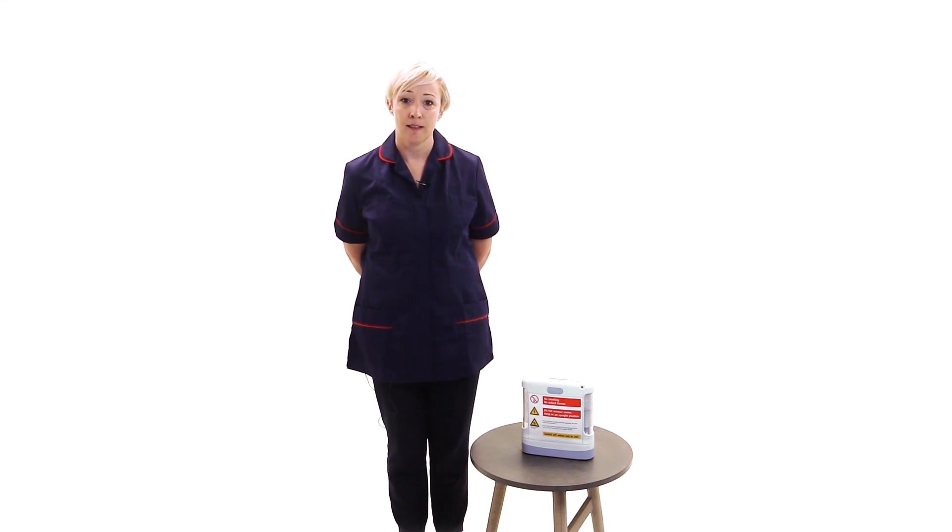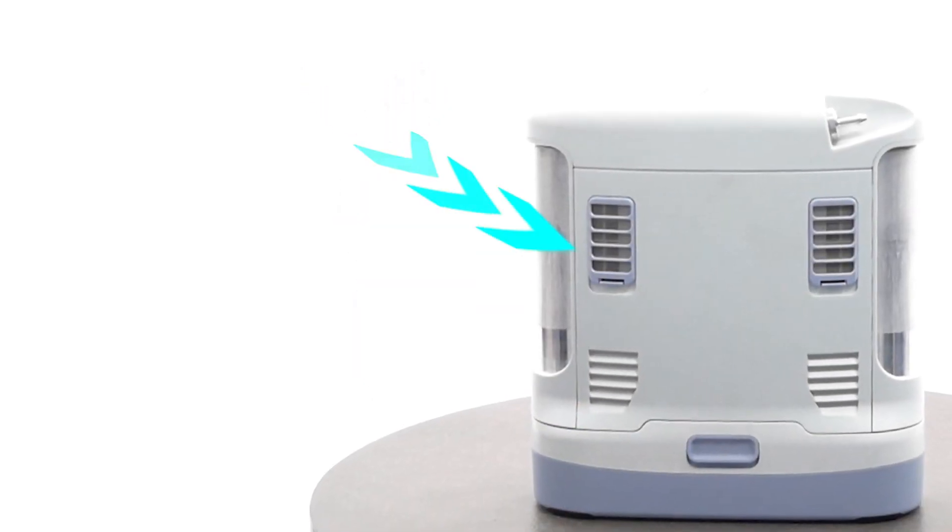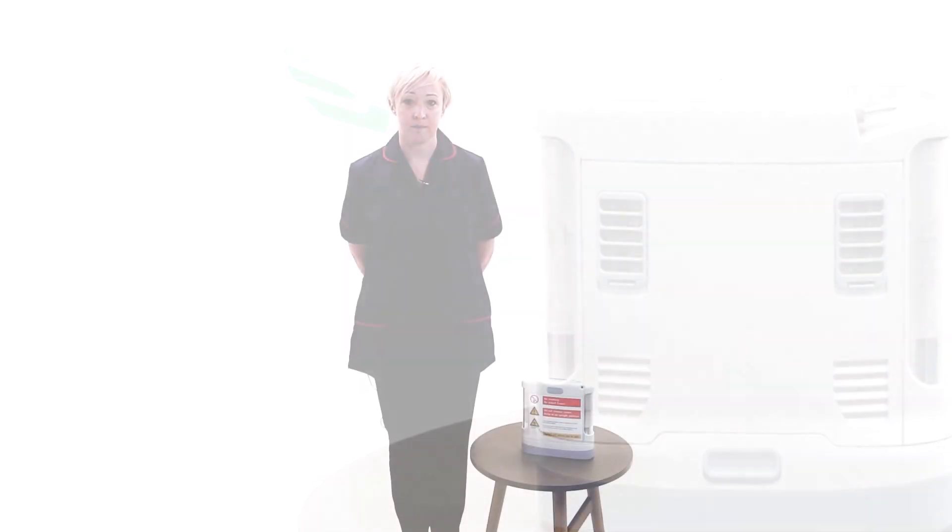You have been provided a portable oxygen concentrator as part of your oxygen therapy. The portable concentrator works by drawing in air and separating the oxygen from the other gases using a filter system. The filter traps some gases but allows oxygen to pass through. This oxygen, now up to 95% pure, is delivered to you via your nasal cannula to assist in your breathing and ability to get out and about.